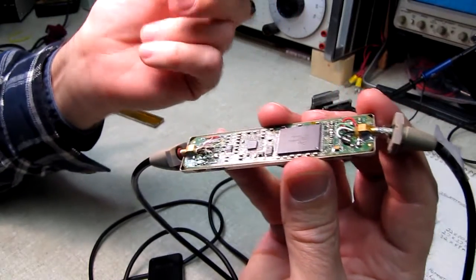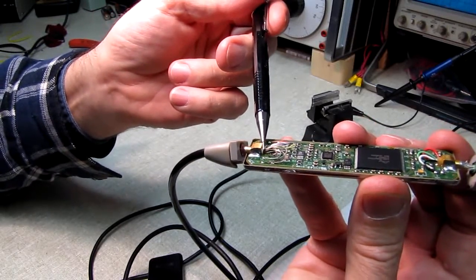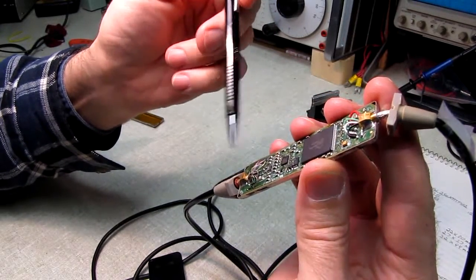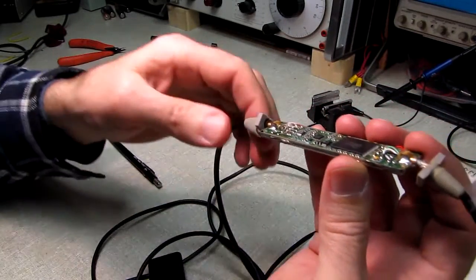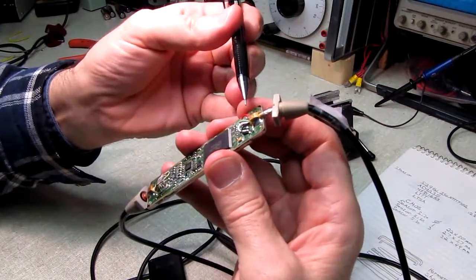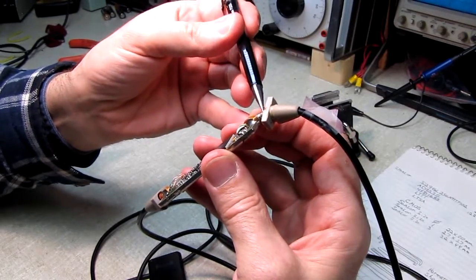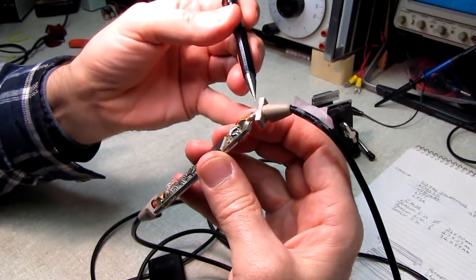You can see there's only a standard 4 wires. Over here, we have the end coming from the camera, or from the imager, I should say. And there's 1, 2, 3, 4, 5, 6, 7, 8, 9, 10, 11, 12, 15 wires coming out of that little guy. So I'm hoping that that hasn't failed, because this cable is soldered in to this little brass strain relief, which means I'm going to have to, first of all, try to get this loose. This almost appears to be molded onto the cable.